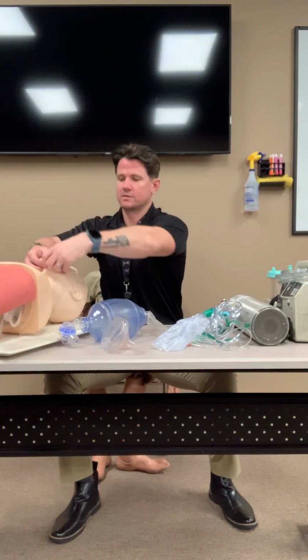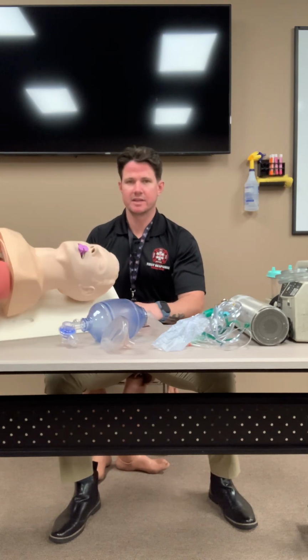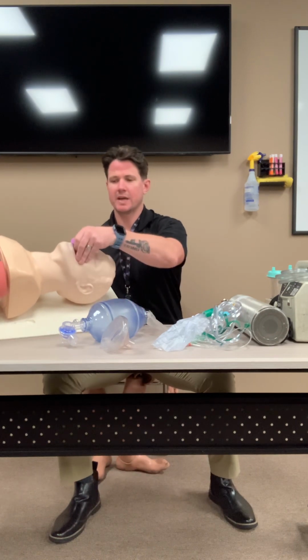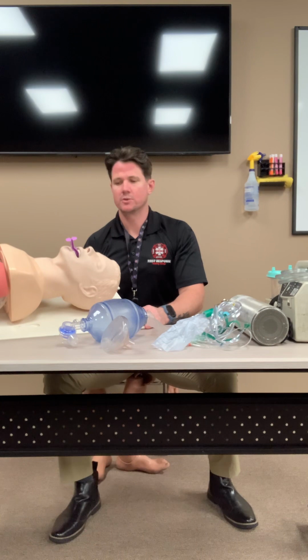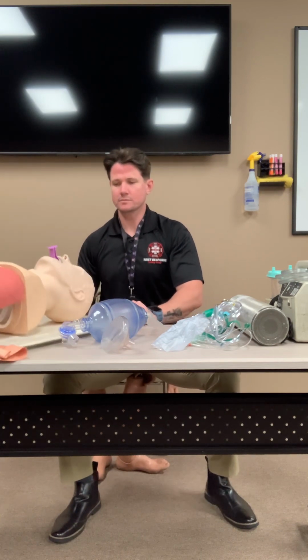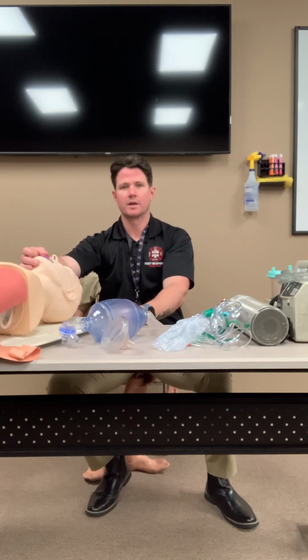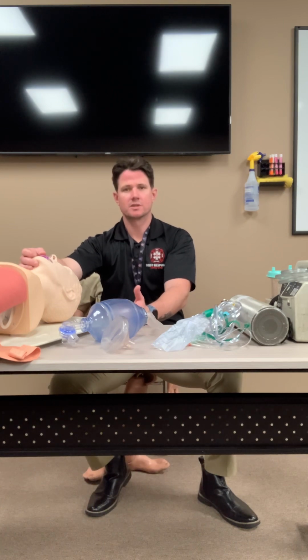As you're inserting it, rotate it away from you towards the patient's chest and push it down. When the flange of the OPA is at the teeth, as it is there, that is correct. If the OPA is like that, that is incorrect, right? You either haven't pushed it down enough or it is inappropriately sized, okay? So now my OPA is in, all right? That's how you appropriately insert an OPA, and those are the most pertinent indications, contraindications, and things you need to know about your OPA, okay?